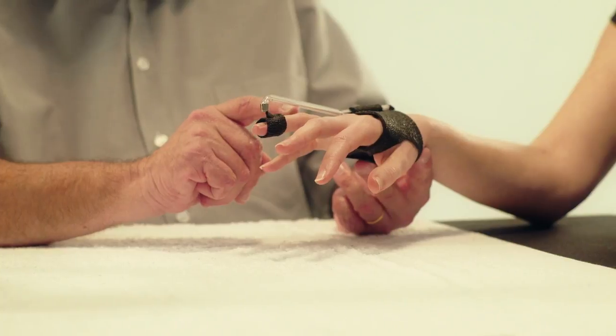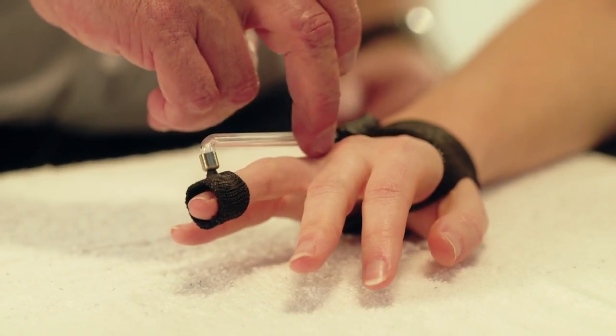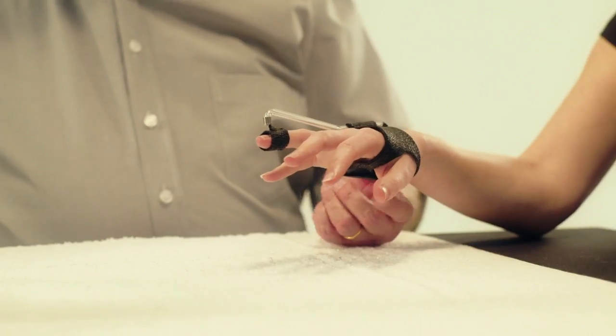However, a hyperextension of the MCP joint must be avoided. To do this, we have to create an MCP stop.